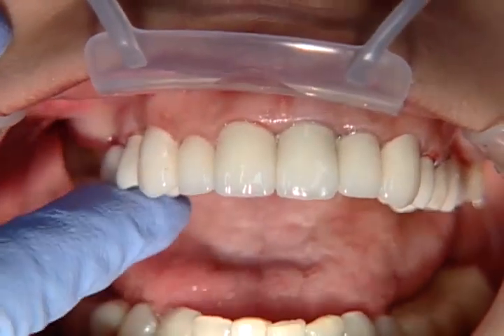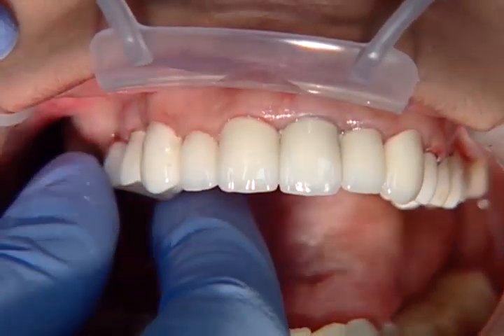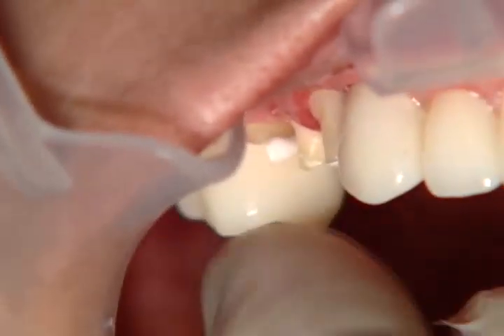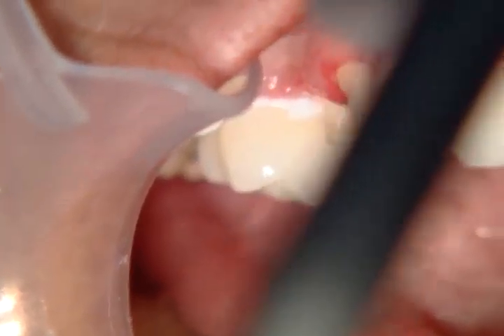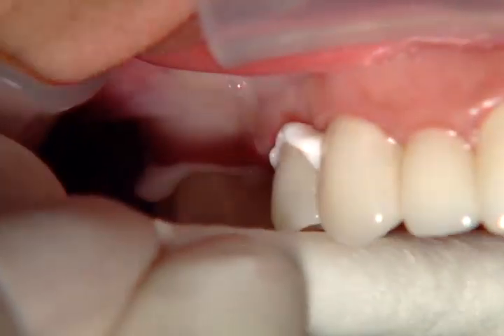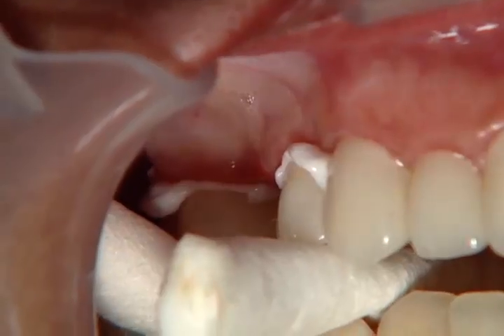So again, we try in the restorations and make sure that the vertical is where it's supposed to be, and then place these in. I always place the anterior restorations first, because if we blow the smile line, then we've lost a lot of the case. And so we put those in first and then typically work our way back, checking to make sure that the occlusion's okay. Again, patient biting on a couple cotton rolls here. This will not cause any problems to the restorations.